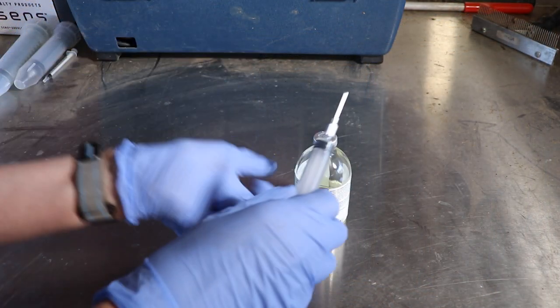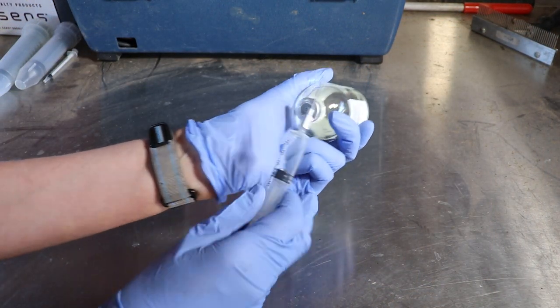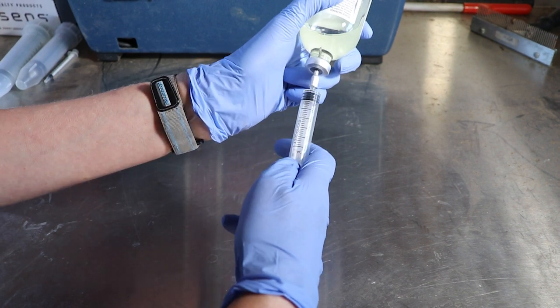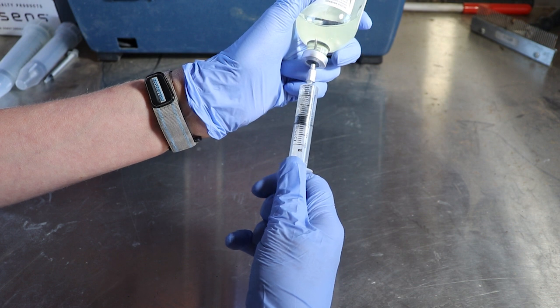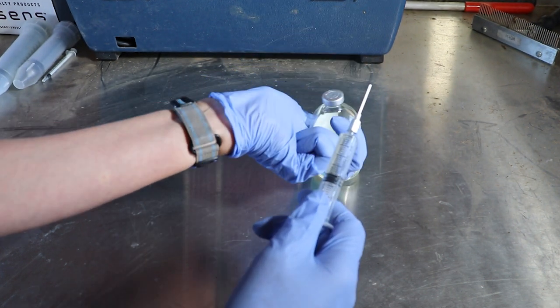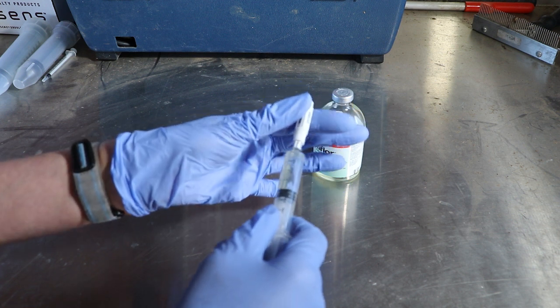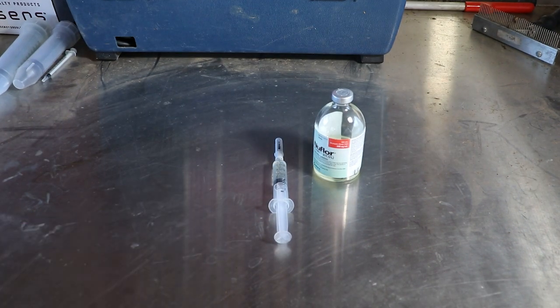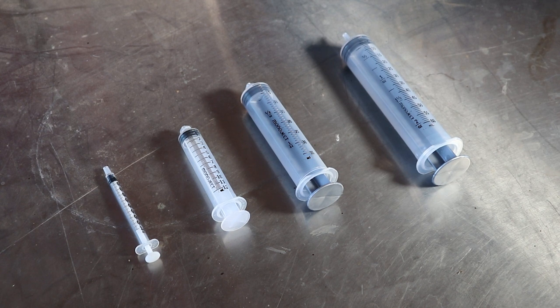But what about when higher volumes of a drug have to be administered? Most people will use a single dose syringe for that purpose. Depending on the volume you have to give, select the appropriate size of syringe. Your dosing will be most accurate if you use a syringe size that will be filled at least half, but where you also don't have to overfill the syringe.